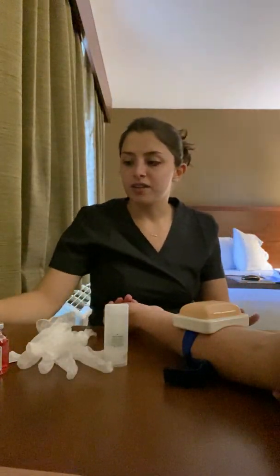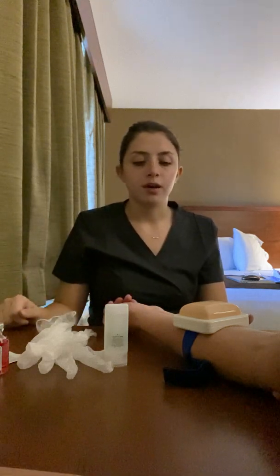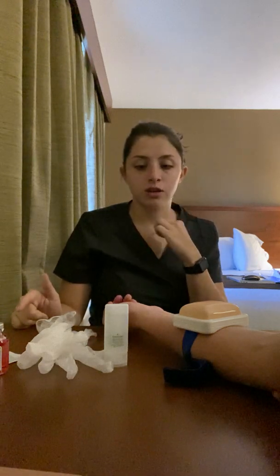Okay, so I have gathered all of my materials. I'm going to verify the 6 rights of medication. So the patient is Bridget Kaiser. The medication is going to be the tuberculin skin test. The dose is going to be 0.1 milliliters. The route is an intradermal injection. The time is 1 time now, and I will be documenting afterward.